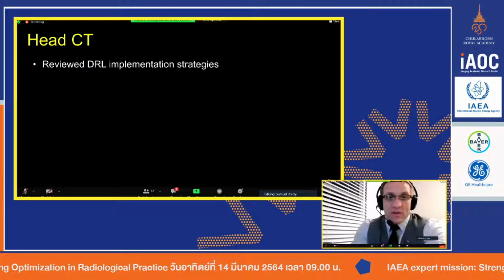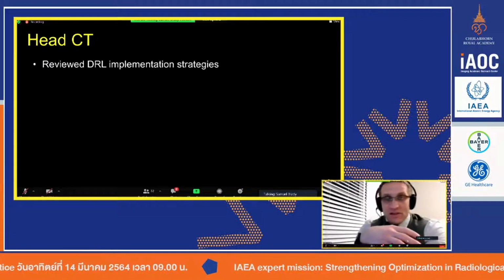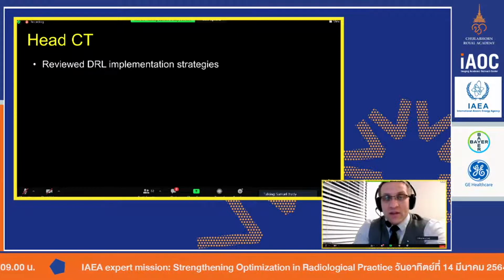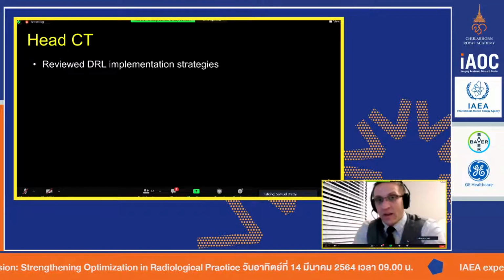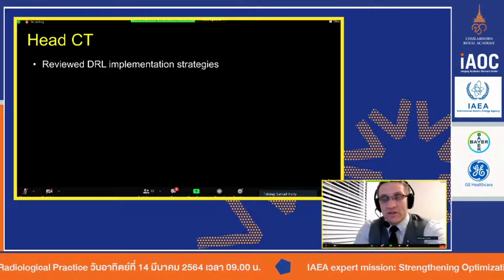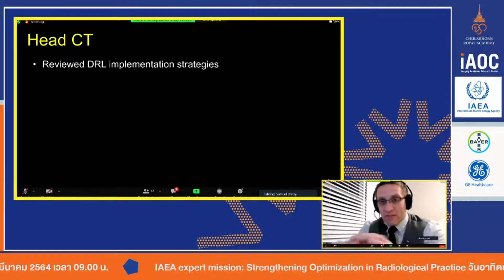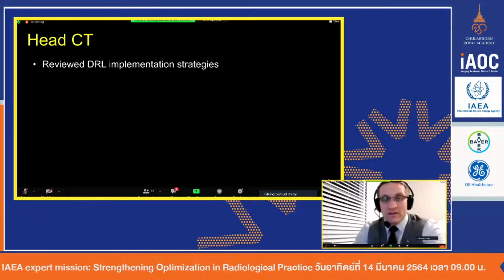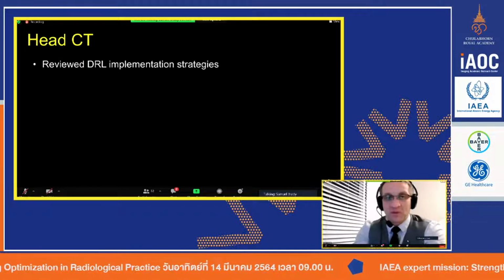All right, we reviewed DRL implementation strategies. I gave you two examples on how we looked at our values here in the US and then how the Japanese, at least in that one study, looked at theirs. The way they approached it, we did ours as a stepwise process, just a little bit here, a little bit there. And at every step, we reviewed the results with radiologists. In the Japanese study, they used a phantom to establish the initial change, and then they made an intervention and made a change, and then they were okay. So they only made one change, and they just went all in on that one change. Either way is perfectly fine.